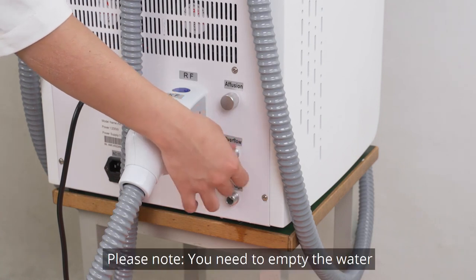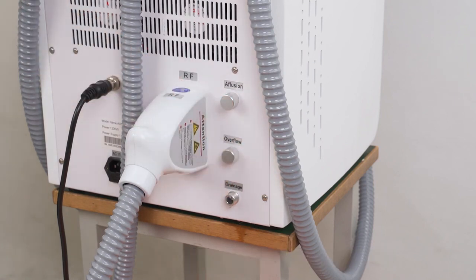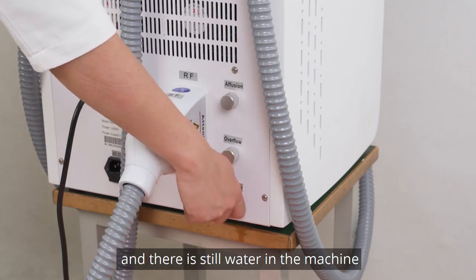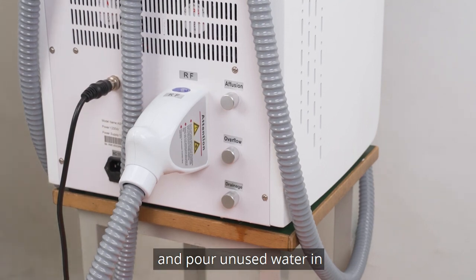Please note, you need to empty the water out of the machine if you keep it idle for a long period of time, and pour fresh water in when you use it again. When it has been 2 months since last use and there is still water in the machine, empty the remaining water and pour in fresh water.